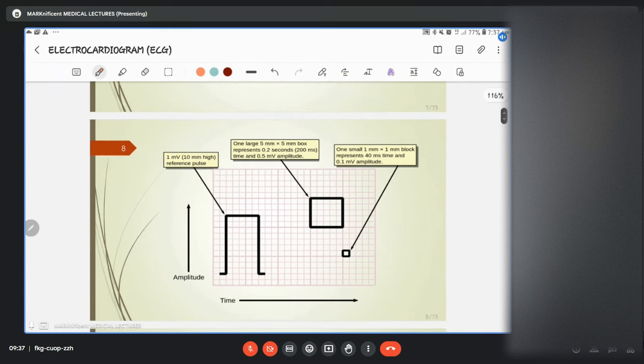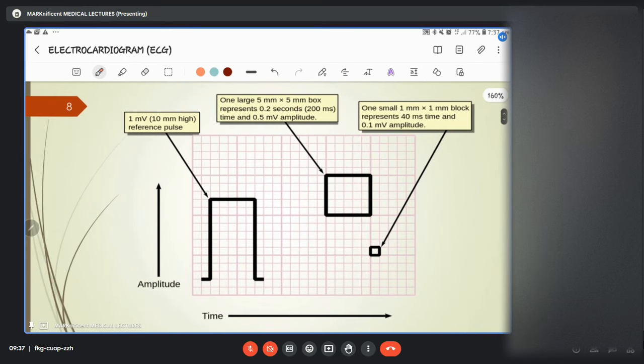When you pick the ECG itself, you should first note that you have these small boxes this way, another one, 2, 3. That is the first thing you should note on this ECG graph. Secondly, you have 5 here, 5 here, but as a whole they form a bigger box.